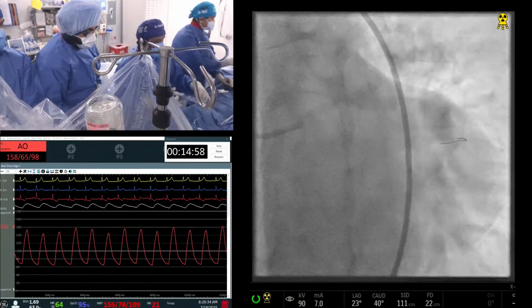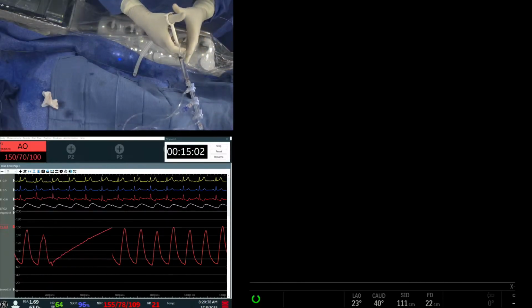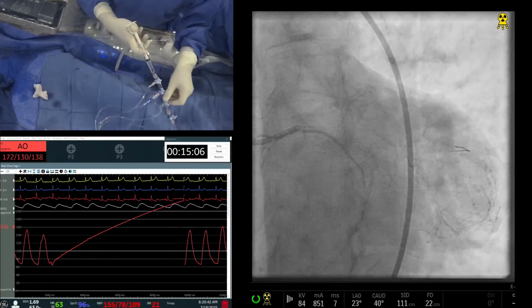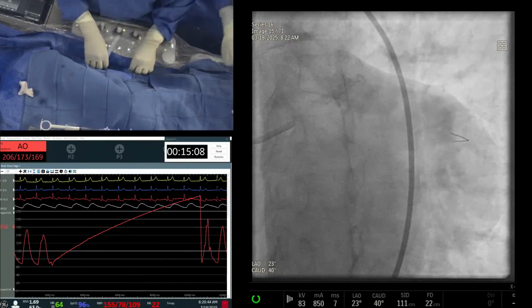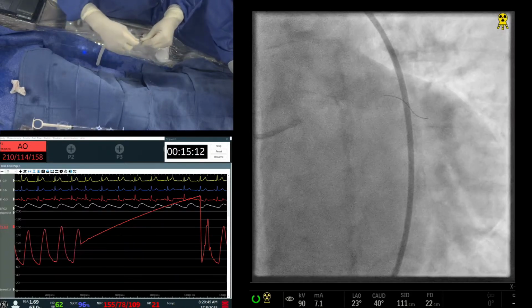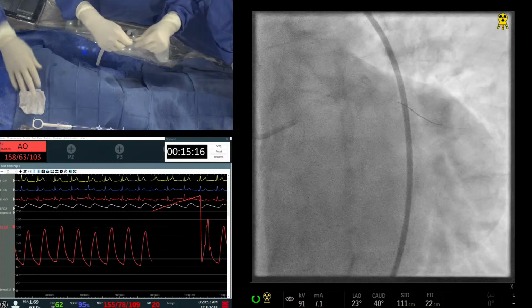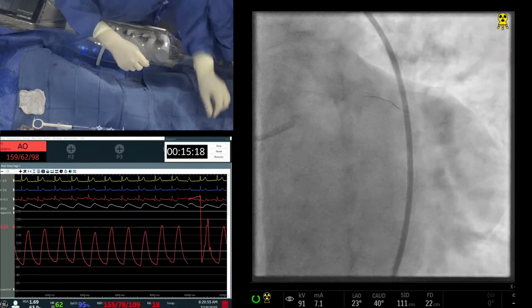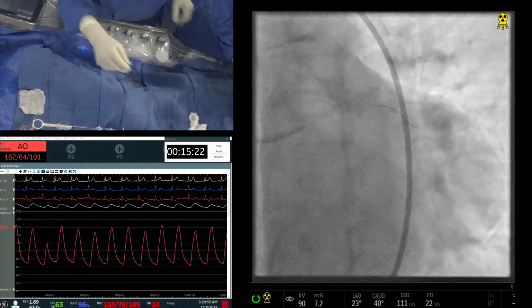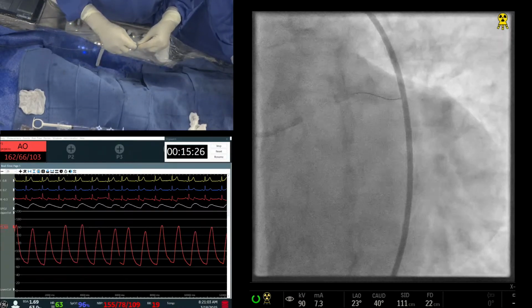So we see the distal edge. Let us see on cine first. Okay, go. You just pull the wire back. We can go to cranial view, or into the other vessel, the bigger branch, the lower one. And we have enough room there. Since it's a branching diagonal, you've got to be sure which way the burr is going to go when it exits.